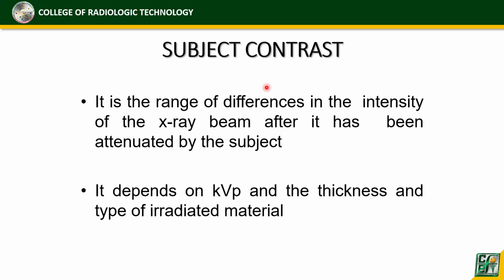So subject contrast. It is the difference, okay? The difference in the intensity of X-ray beam after it has been attenuated by the subject or body part. So subject contrast depends primarily on KVP and the thickness and type of irradiated material.